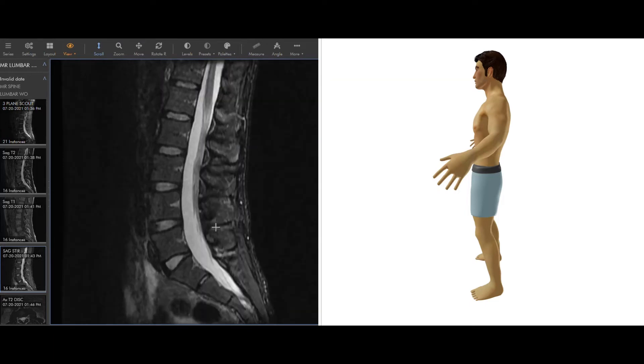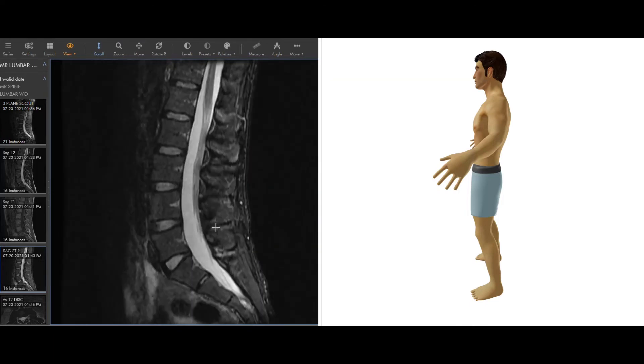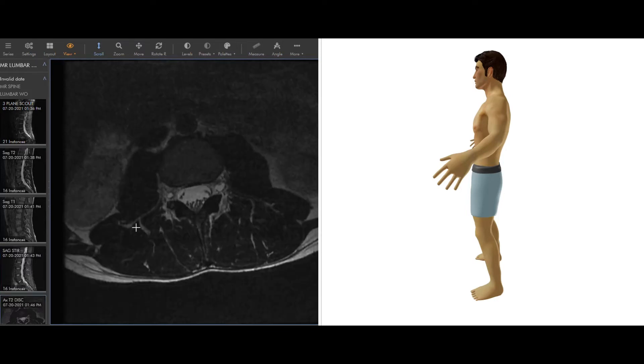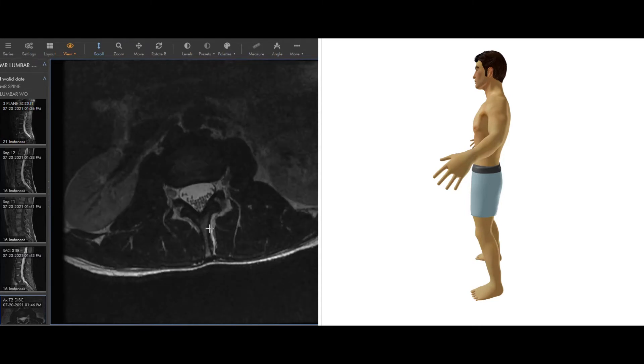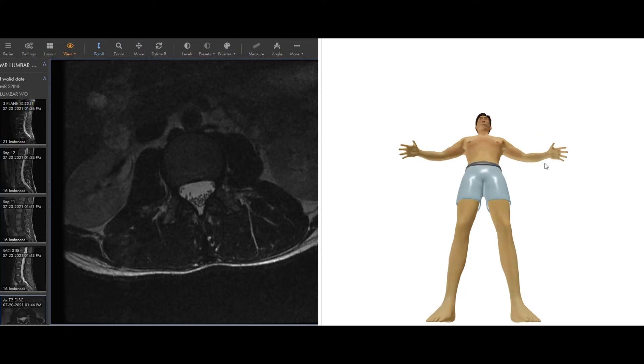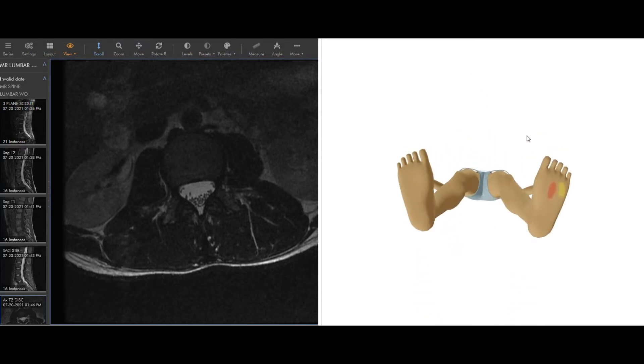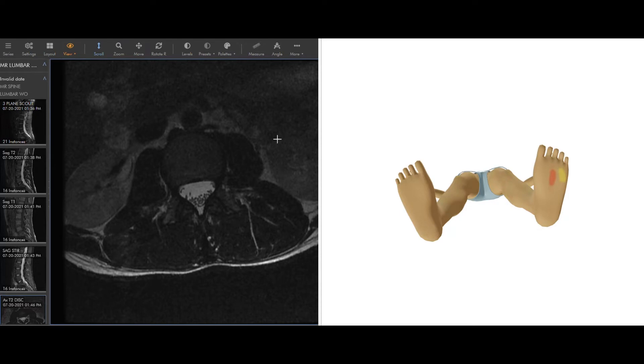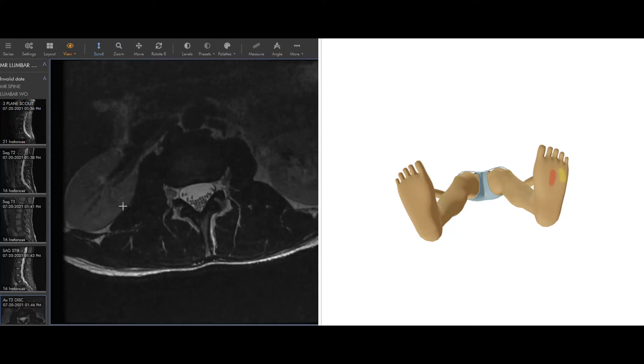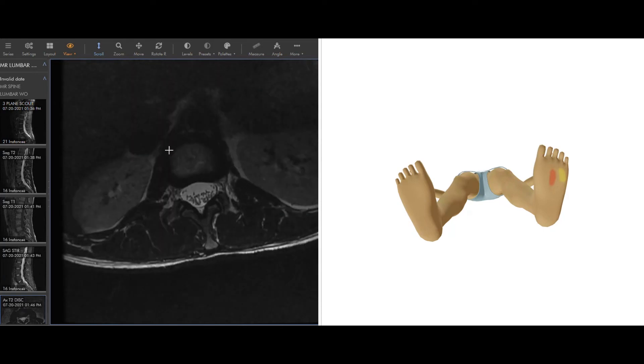A STIR sequence is one of those types of sequences that can do that. Some sequences are going to be abbreviated with fat sat after them or FS. We can see here this black fat on this scan. Most MRIs are done in at least another view. For example, this is a T2 again, but it's done in the axial view, which is basically done from the feet up towards the head. So this is the right side, this is the front, this is the back. This would be an axial T2, but everything else is sort of the same. You can see here are some kidneys, and then the abdomen has a bunch of fat in it too, so you can see this bright here, this is just fat within the abdomen.